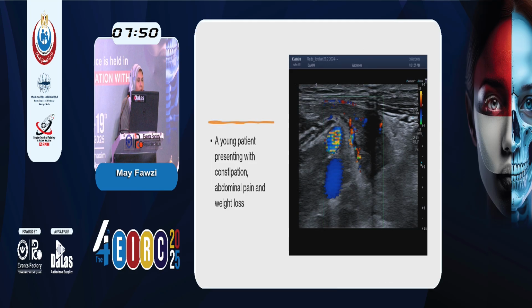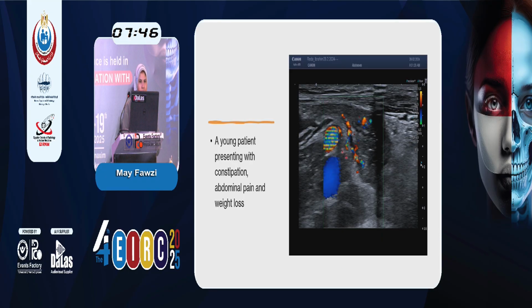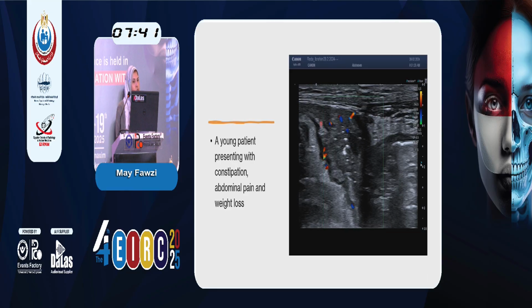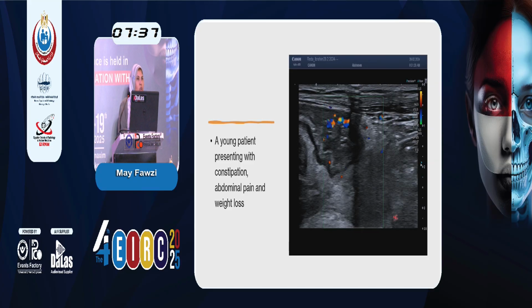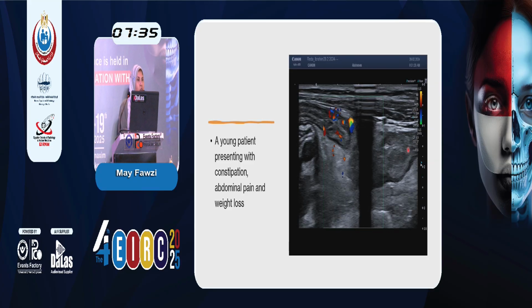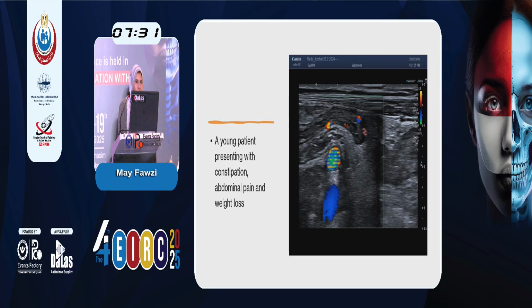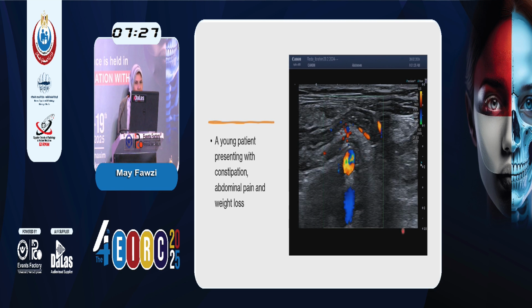Okay. And if you note, this is his terminal ileum right there. It's stenotic, the lumen is empty, there is increased vascularity everywhere, and look at this, pre-stenotic dilatation. Seen very well, I can tell this patient has a problem. And there is, of course, excess mesenteric fat hypertrophy.